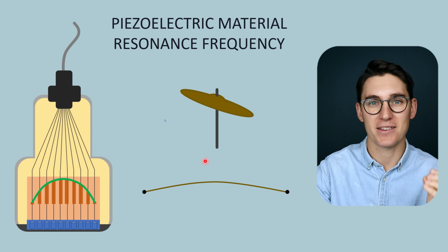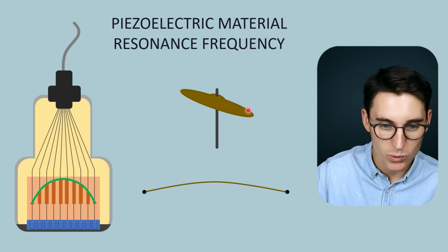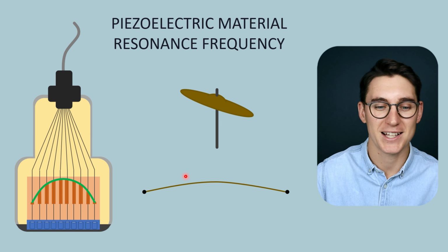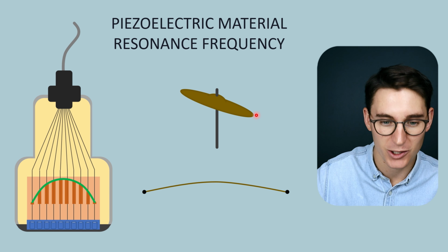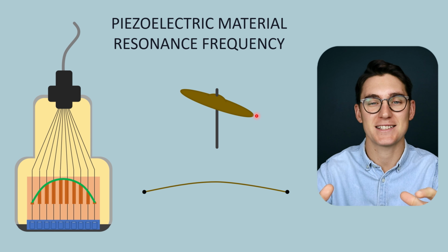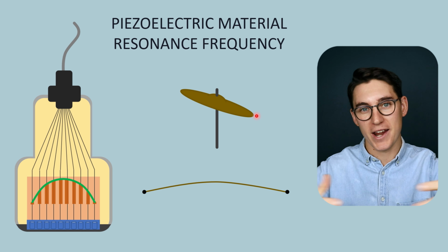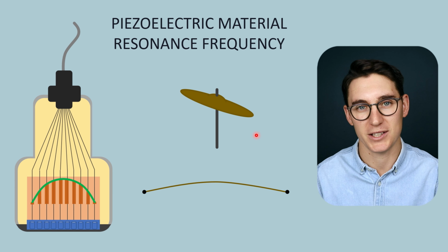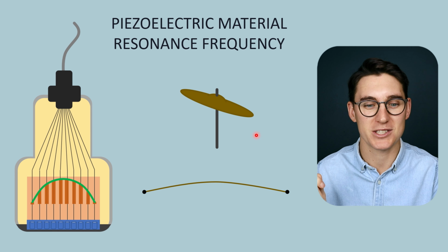Now when I think about the piezoelectric material, I think about it in two separate ways. The first way I think about it is one of these units, one of these PZT crystals, as being a cymbal. On a drum set you have the cymbal that can be hit here with a drumstick, and when you hit that cymbal it will resonate at a set frequency. Now the wider or the bigger the radius of that cymbal is, the lower the frequency of that sound when we hit it. The smaller that cymbal gets, the higher the pitch, the higher the frequency will be.